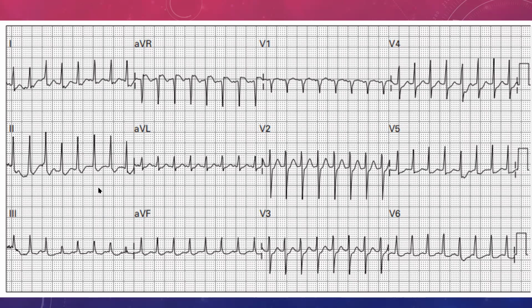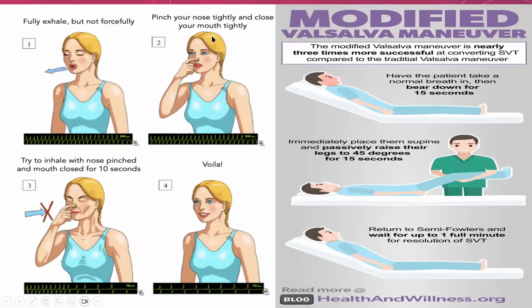Now, this is not the only slide. Let's move on to the next one so that we can have a look and see. Okay, let me just hide this, sorry. Panel controls. Okay, so you've decided that your patient has a supraventricular tachycardia.